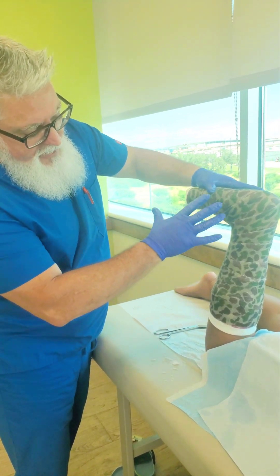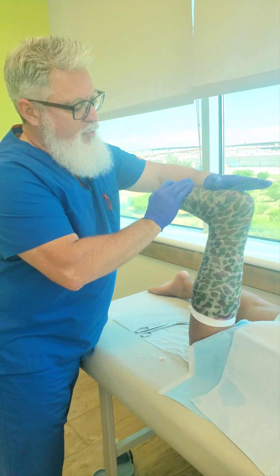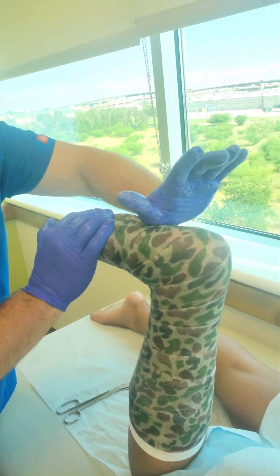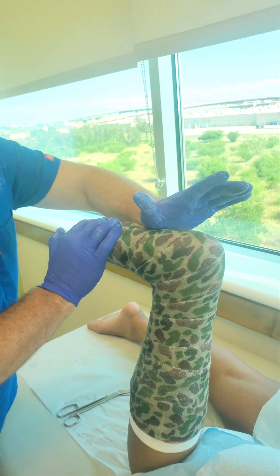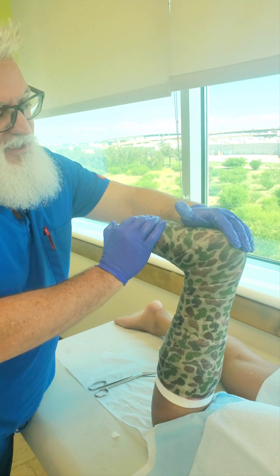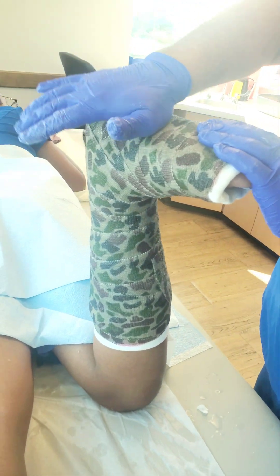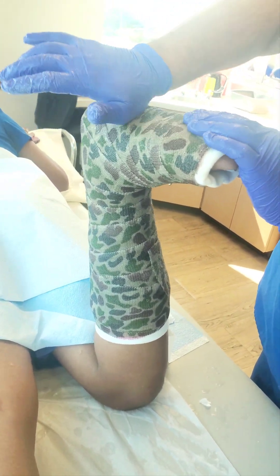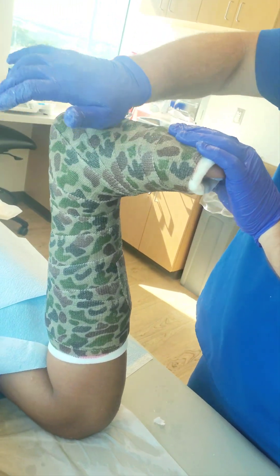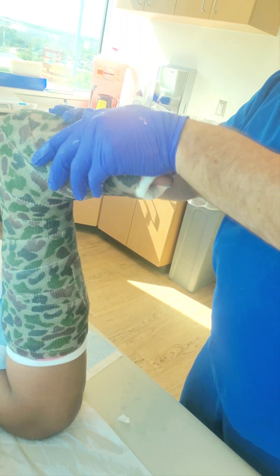The first mold you can do — if you have the patient in this position — is to use the fatty, meaty part of your hand right where the arch would normally be, and use that thick part of your hand to create the natural arch in the foot, just like so. You can actually see the mold starting to happen as I'm doing it. It doesn't take a lot if you address it while the cast is still curing. That is the standard arch mold.